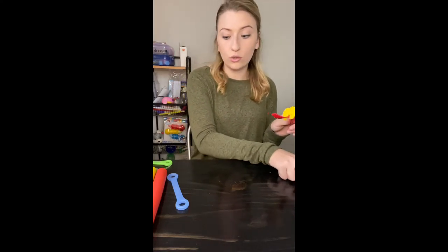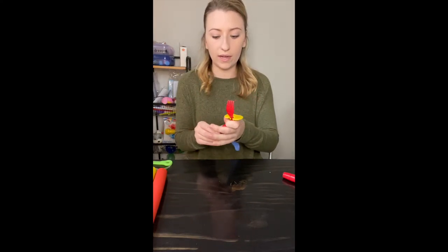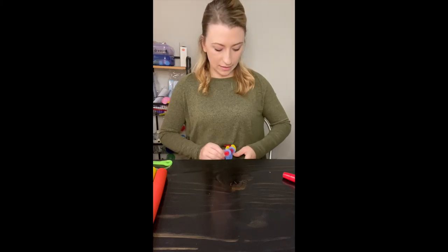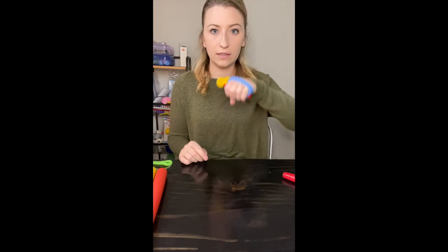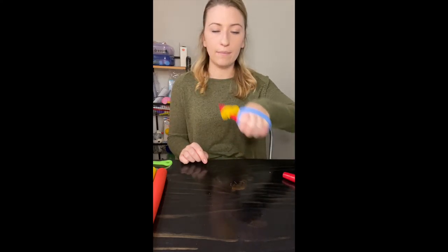I was actually recommended these by another OT friend, and you can even use these with Easy Hold — I think that's how I found them. These are left-handed and I keep forgetting, but you just insert your hand or your child's hand and there it is. Stab, bring them out, and that's it. Easy peasy.